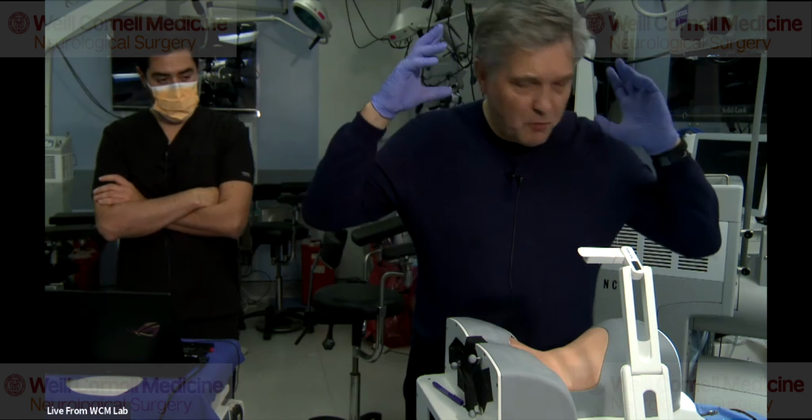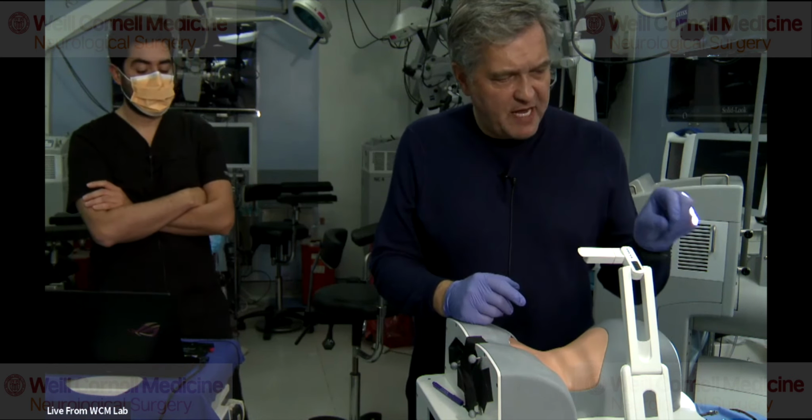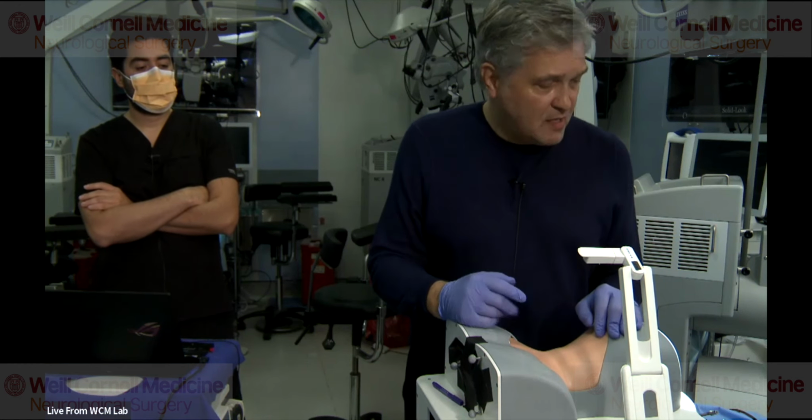So with navigation, what I would typically do is I immobilize the patient's head in a Mayfield head holder. I would have a reference array attached to the Mayfield head holder, and then get a fluoro CT scan or a true intraoperative CT scan. And some of the new intraoperative CT scanners now allow you to modify and minimize the amount of radiation.